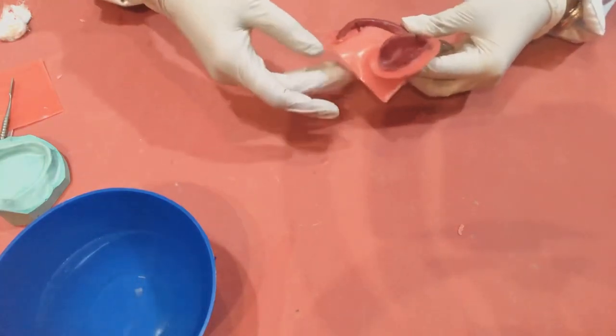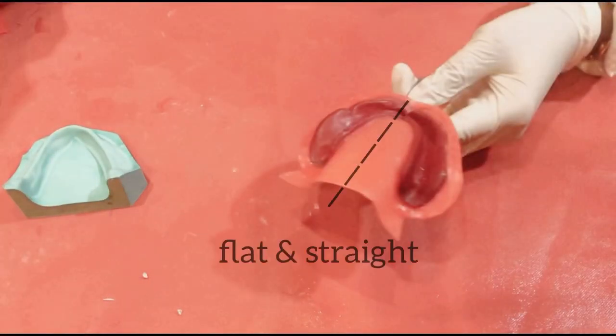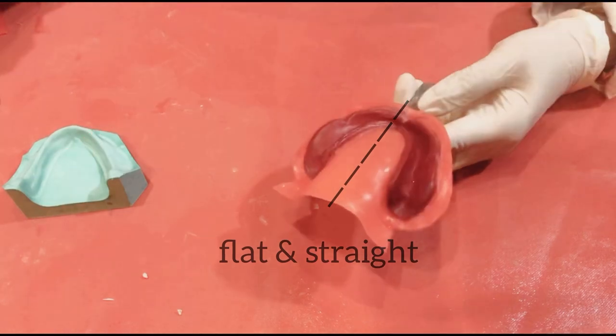Some important points to keep in mind are: see the tongue space wax should extend flat and straight, only then you will get a flat straight tongue space on your cast.